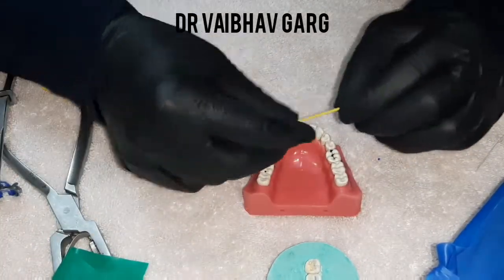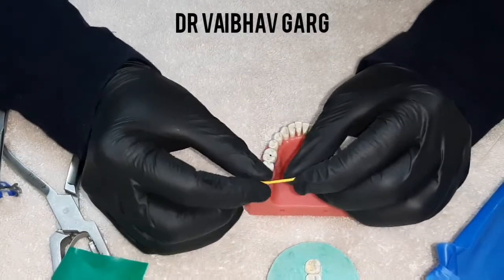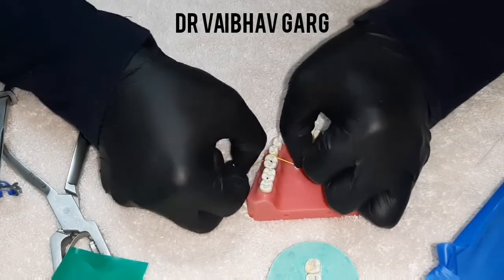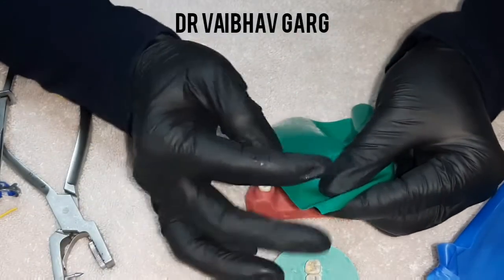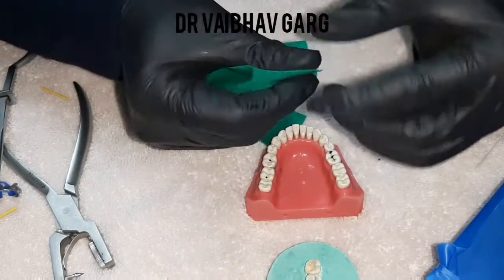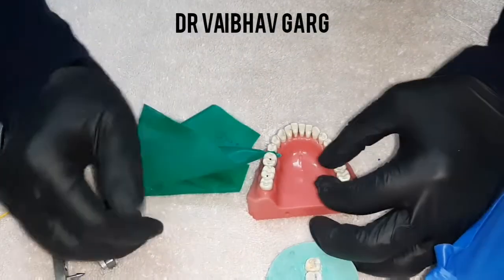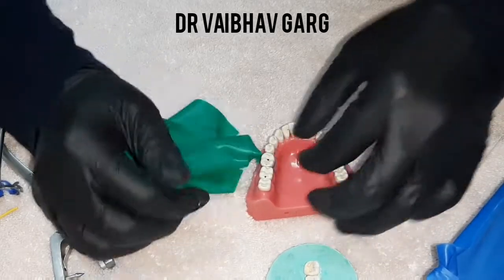In case you don't buy Wedgex or run out of it, there is another indigenous way to cover interdental areas properly. You can cut a small corner of the rubber dam sheet and place this piece inside the interdental space — it stays there and gives a good hold for single tooth isolation.